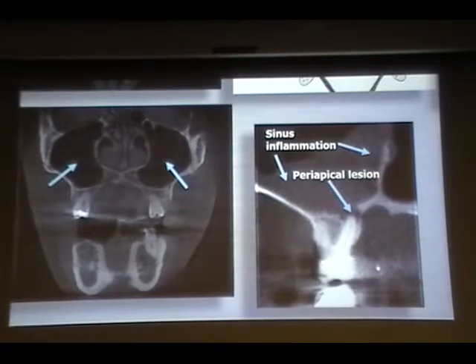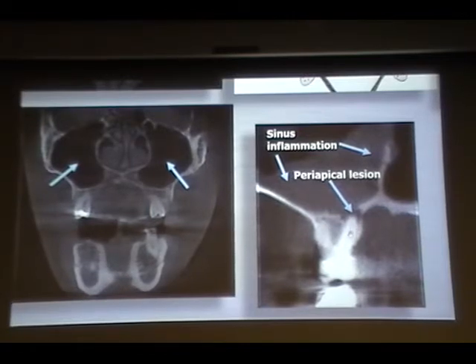What I want you to observe here is there is a tooth and some white-like material, also called hyperdense. That means there is an artificial crown placed. And at the apex, you can see there is a black area, also called a hypodense region.